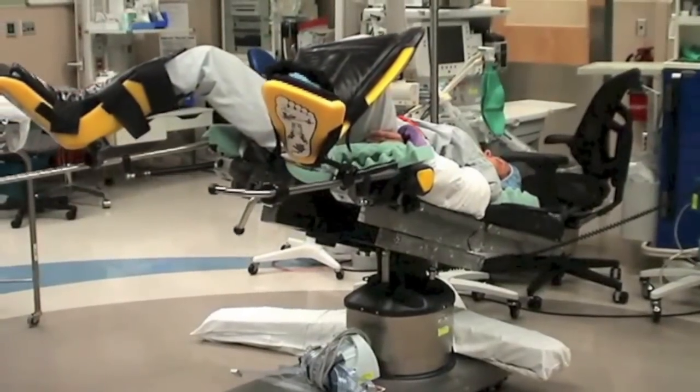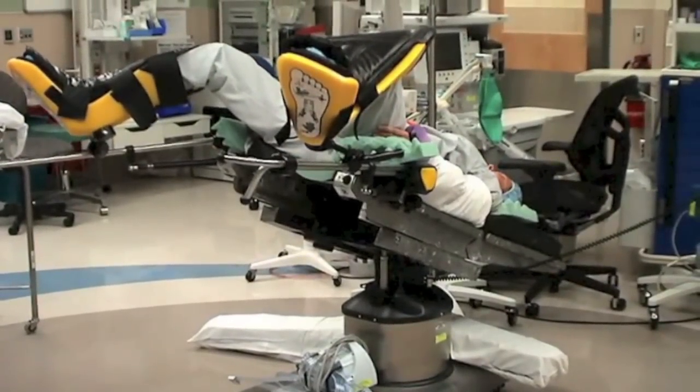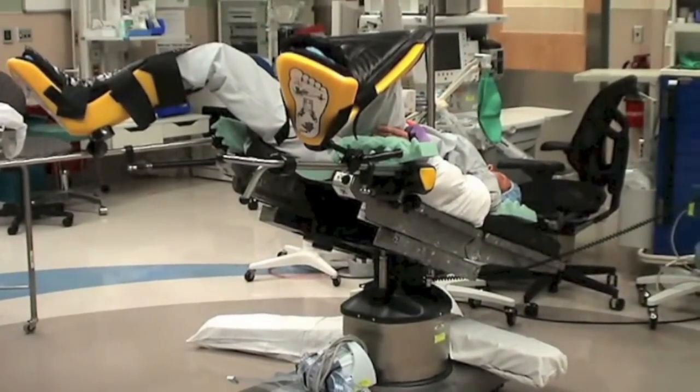Finally, the patient is able to be placed in steep Trendelenburg and maintains her position on the OR table.